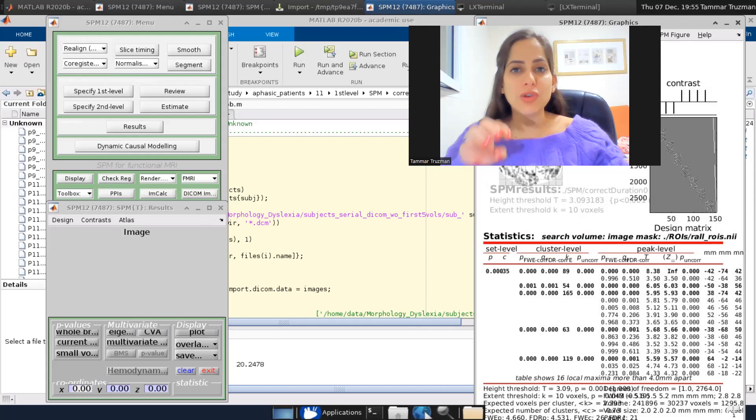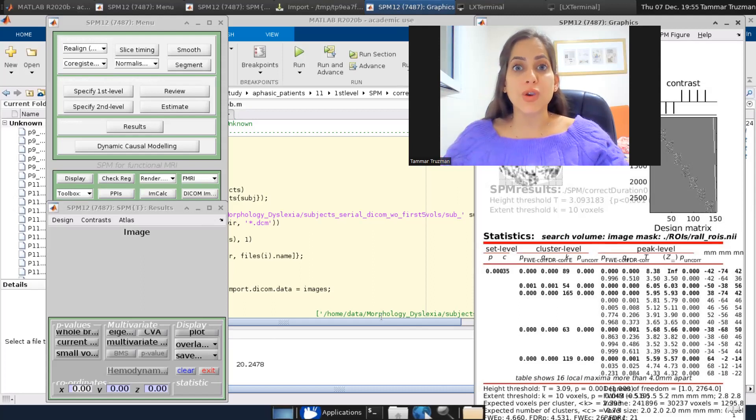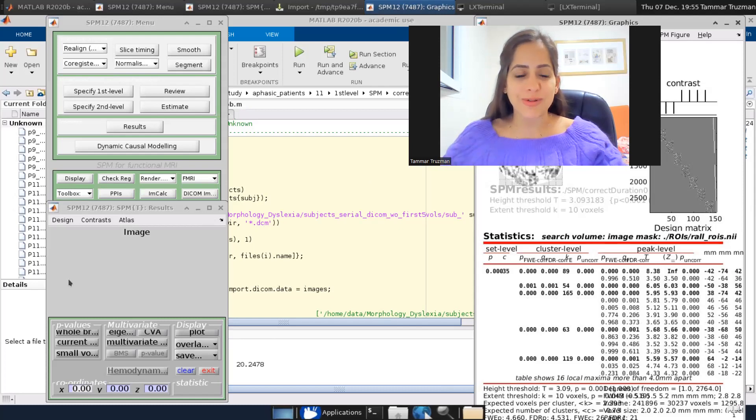Now I'm going to use this high threshold to correct my results for the VOI. So up to now, I didn't do anything. I just received information from the SPM.